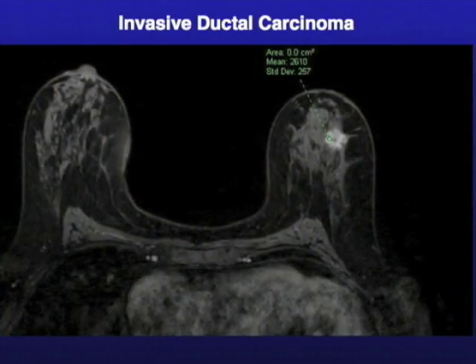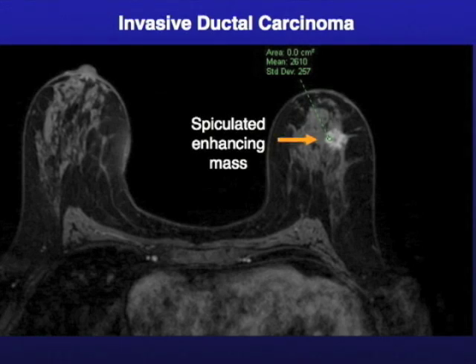This is an example of what a breast MR looks like. That's her left breast and her right breast, and you can see there is a mass. That white thing is a cancer — a spiculated enhancing mass. When we see something like that, we say oh, that looks bad. This is something that needs further workup, and this turned out to be an invasive ductal carcinoma. So this is breast cancer on breast MRI.